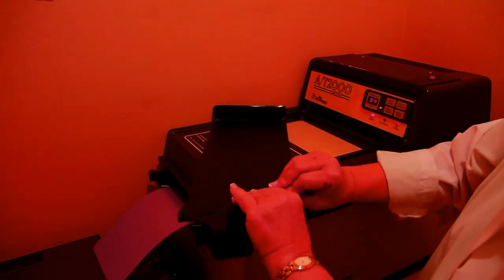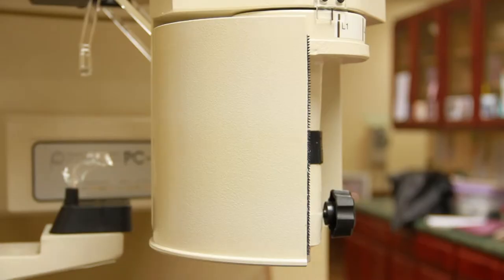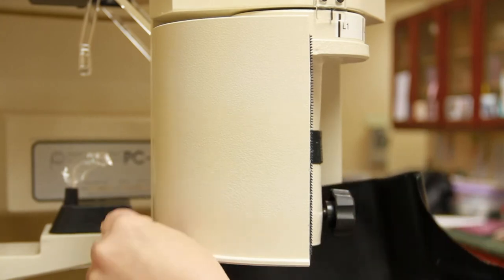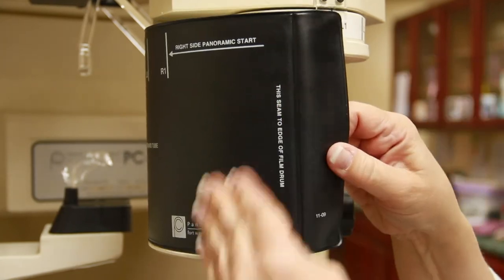Make sure the film is completely in the processor before opening the door. Take the new film and place it on the Panorex machine, making sure it is lined up correctly, and reset it to be ready for the next patient.